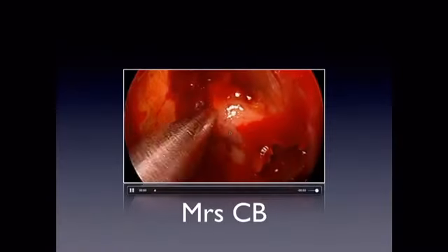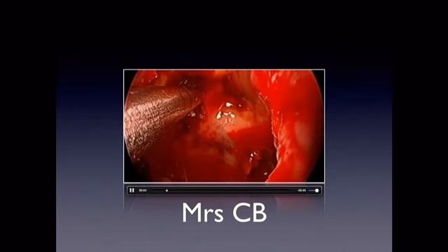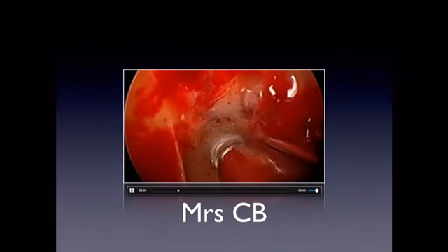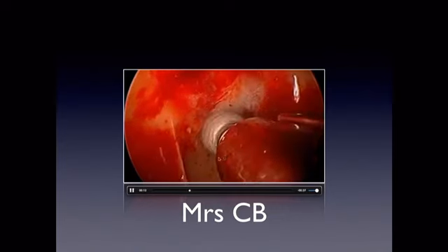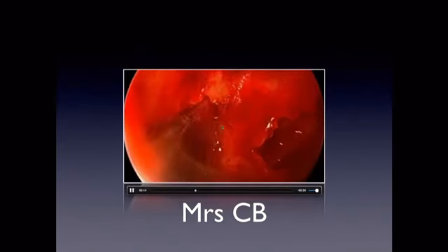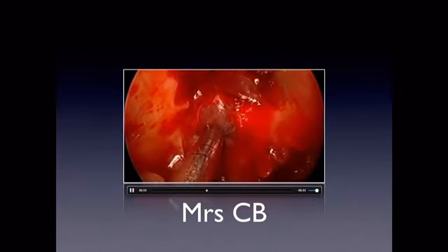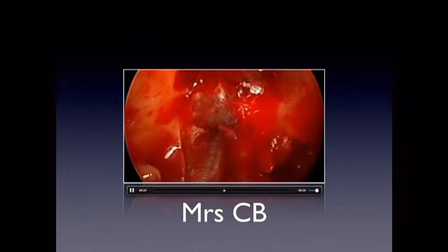And this is her. So what you can see straight away, this is not surgical trauma. That's the medial opticocarotid recess, and there's abnormal tissue coming out through that. So there is some major process going on. Normal pituitary over here, coming underneath where the clivus is, drilling up underneath where that lesion is sitting, taking off a little plate of bone to expose the lesion. And you can see that it's quite vascular. Carotid is sitting just across here, optic coming across there like that.